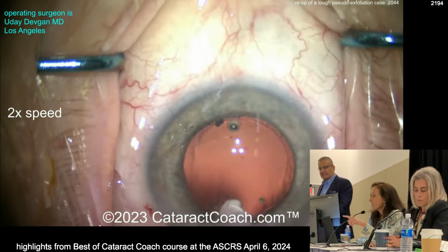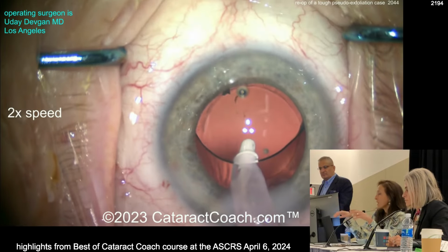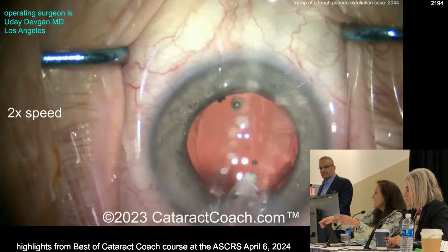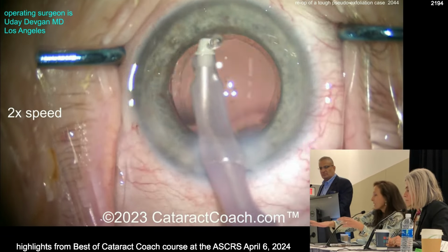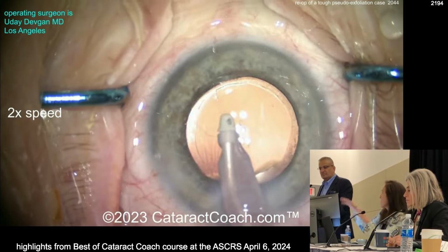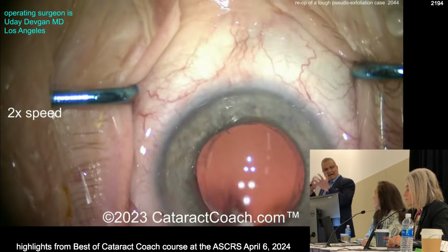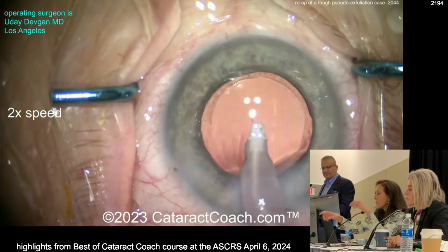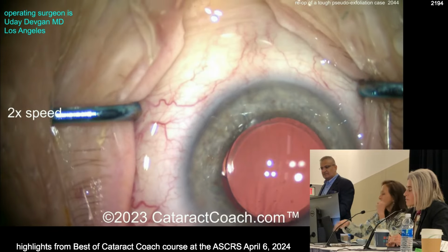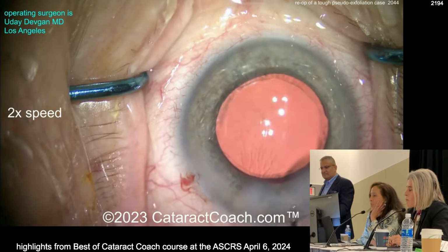The other thing I do in these cases to look for chips is that after I do complete removal of viscoelastic, I actually put the IA probe there and depress from the paracentesis, so you decompress the AC but leave the lens where it is, and any pieces can come forward. Then increase the irrigation again, so you cause a little turbulence to see if you can get some pieces to fly in. Just high flow to push everything around. But you don't shallow the posterior segment. You keep your IA probe there, keep the lens in place, and then just do some fluid shifts.